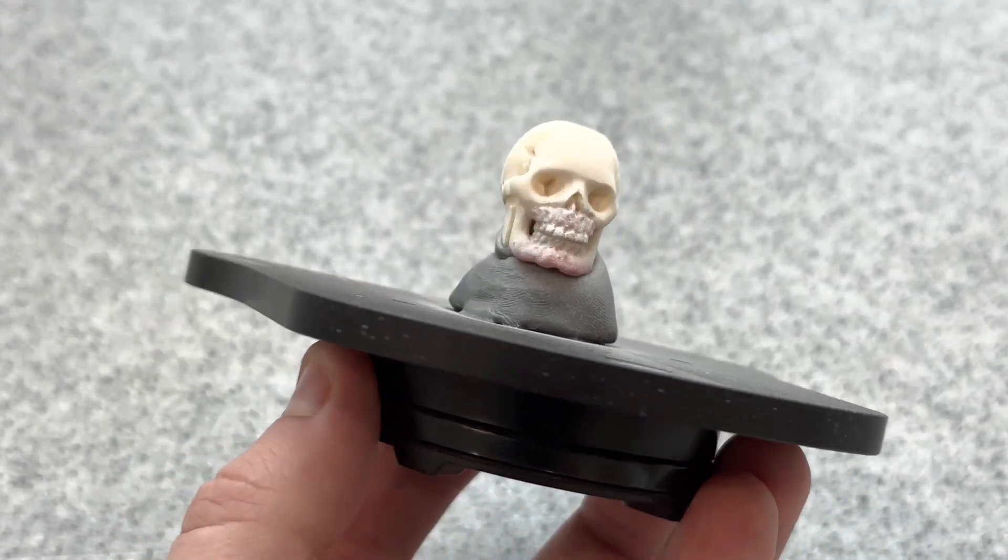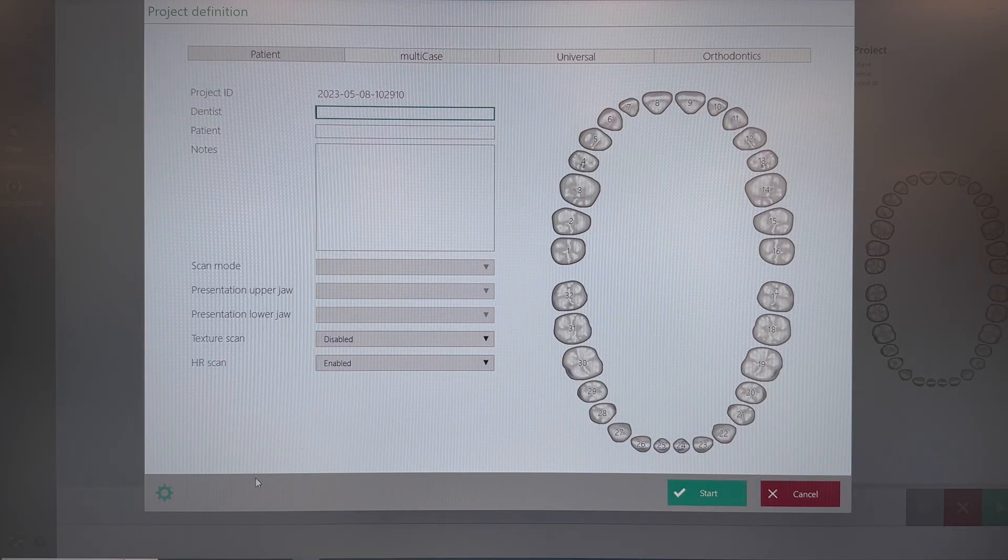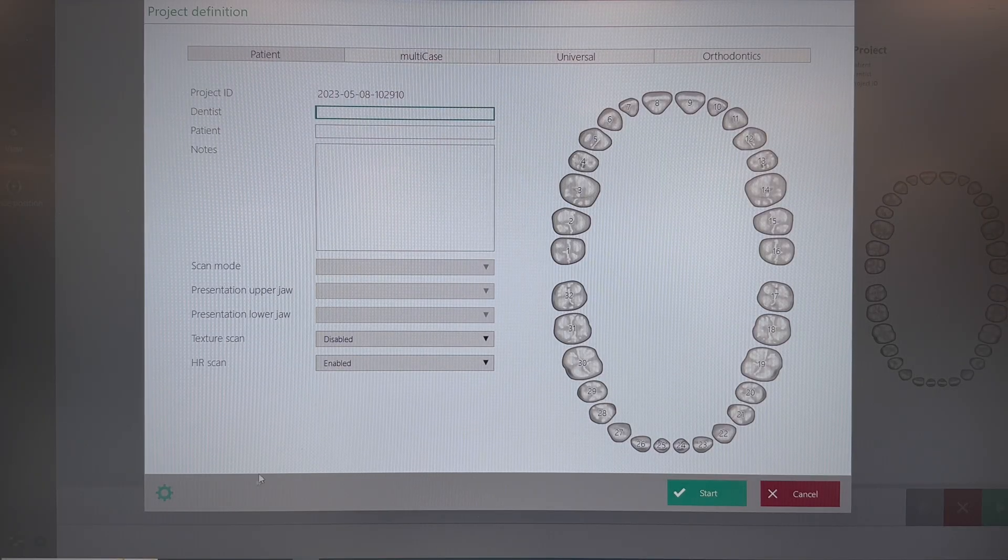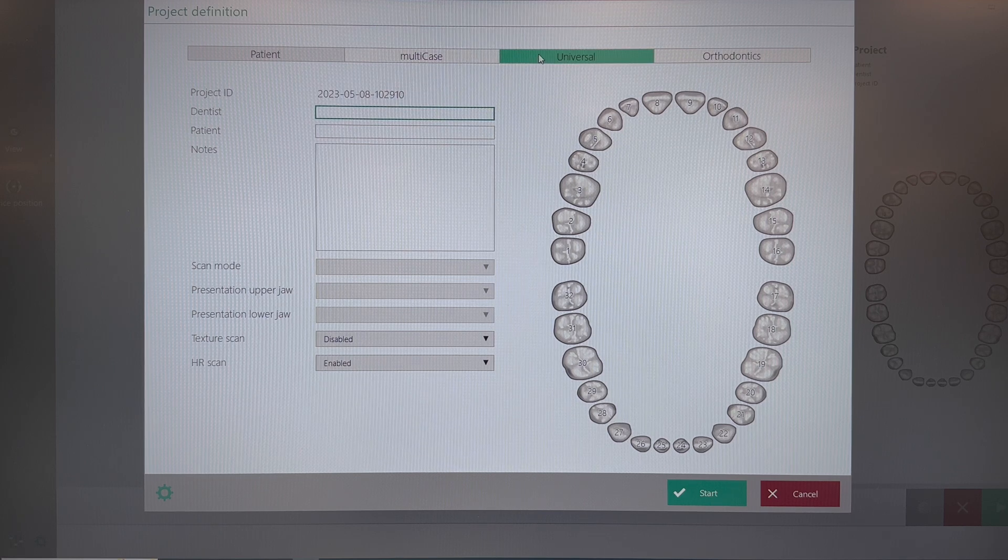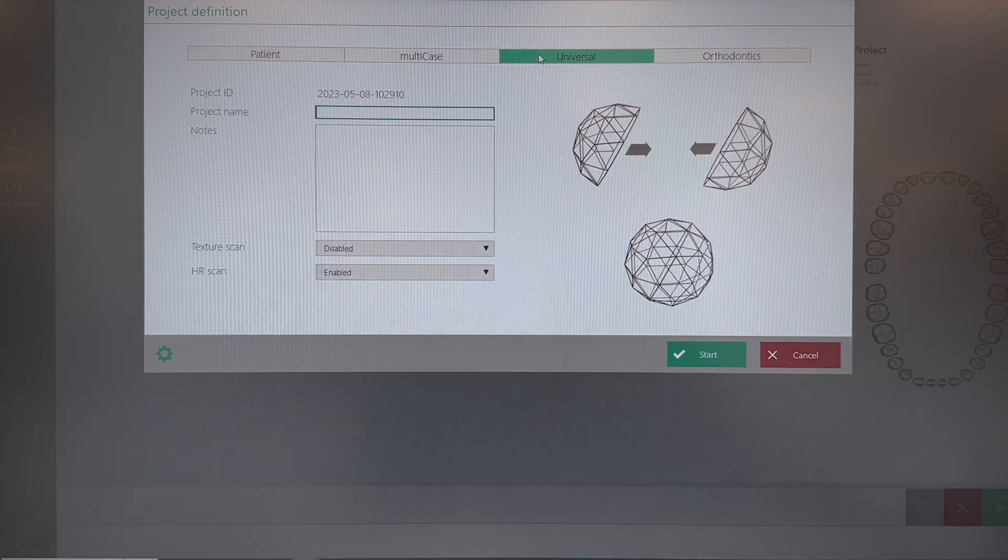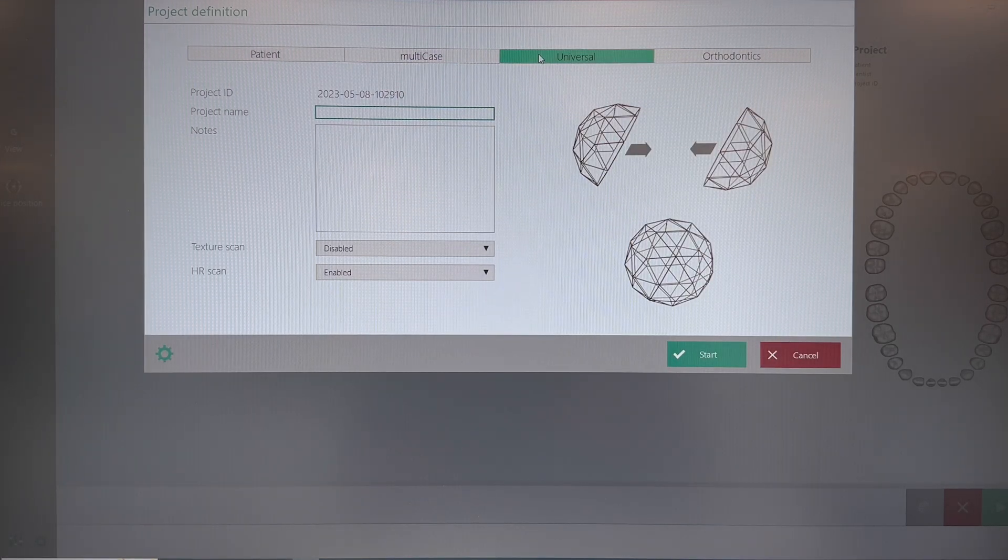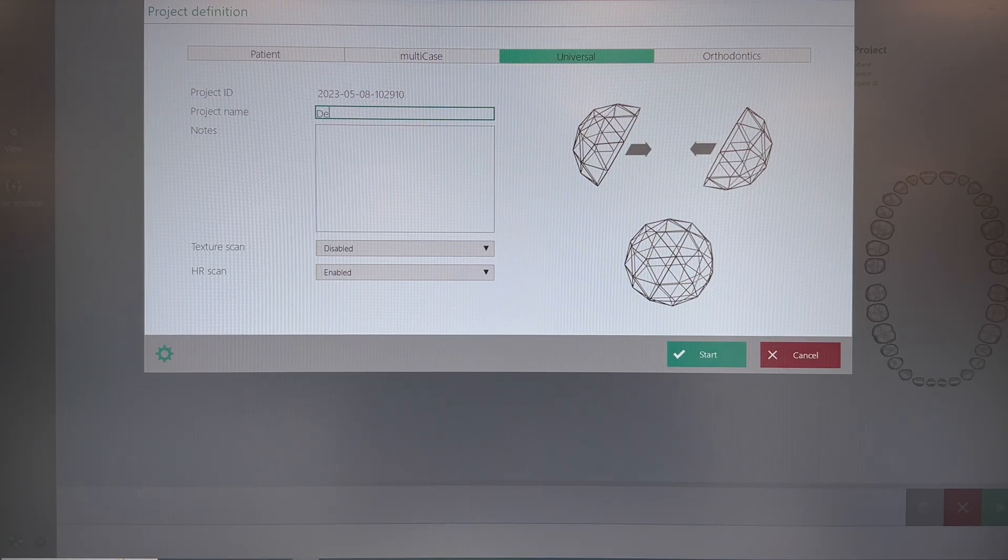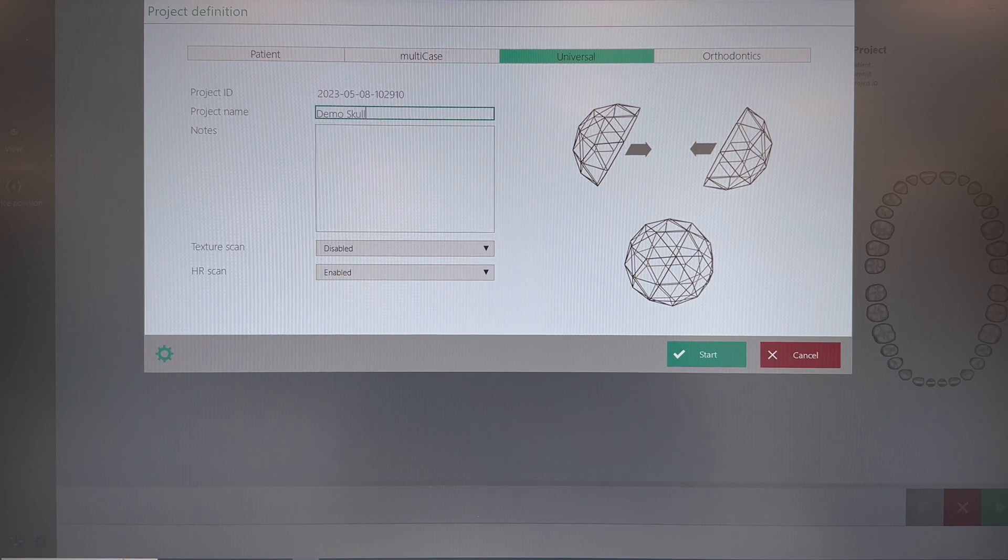Now we're going to open up our AdvoScan software. From the main menu, we're going to go over to Universal Mode and we're going to name the project name. Once you've done this, click the Start button.